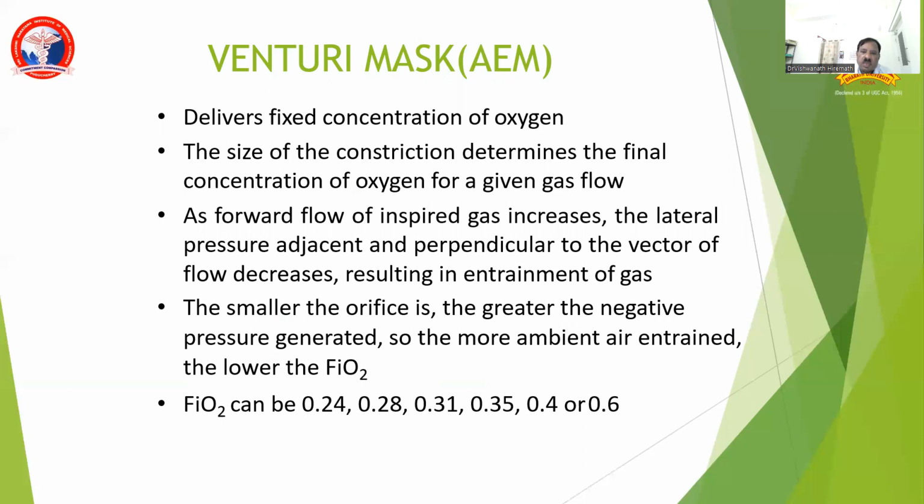Forward flow of the inspired gas decreases the lateral pressure adjacent and perpendicular to the vector of flow, resulting in the entrainment of gas.